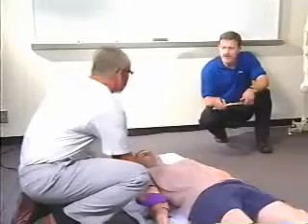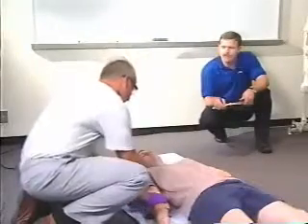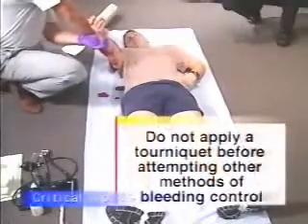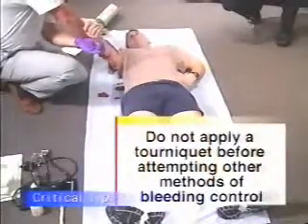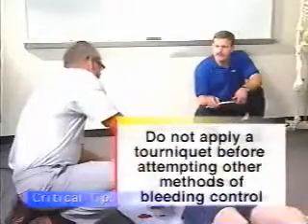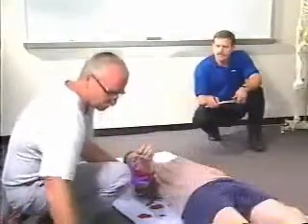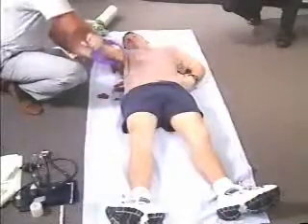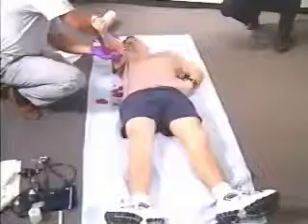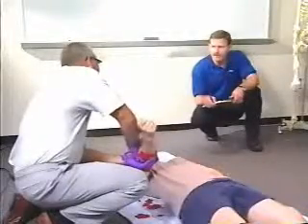Okay, the patient continues to bleed. Okay. At that point, we'll go to elevating the extremity. Is there, he can answer meds, history, allergies. Bleeding is not yet controlled. Okay. Leaving that dressing in place, we grab a larger dressing, apply direct pressure still with it elevated, with the dressing on. Direct pressure and elevation still does not control the bleeding.